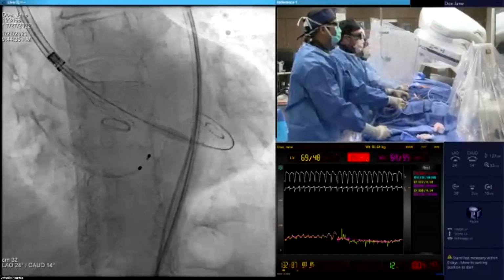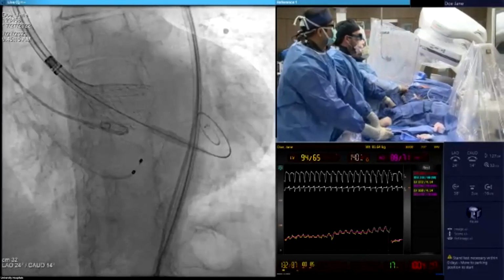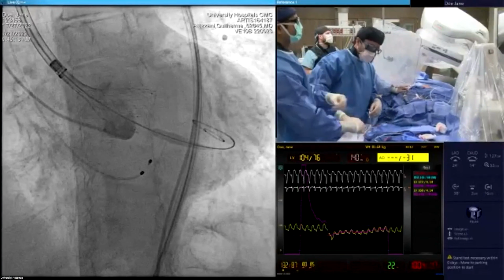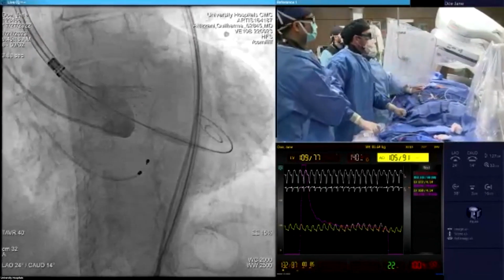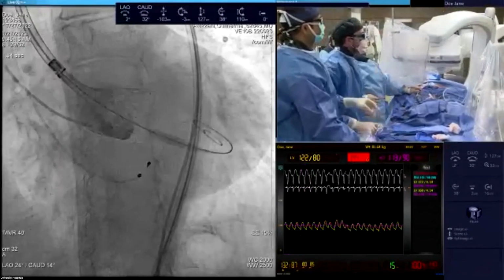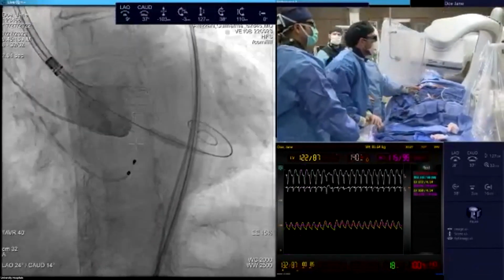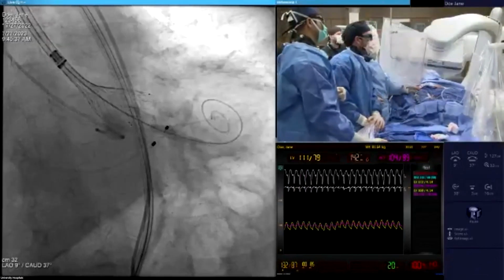Yeah, this is about, I think, 2 millimeters. Cine. Inject. All right, happiness or frustration? That's good. I'm happy in the LAO. Can you go to the RAO and show? Sure. Going back here, we're still pacing the patient, as you can see. If you're asking yourselves why we're still pacing, it's not because I forgot fluoro. Right, seen it?